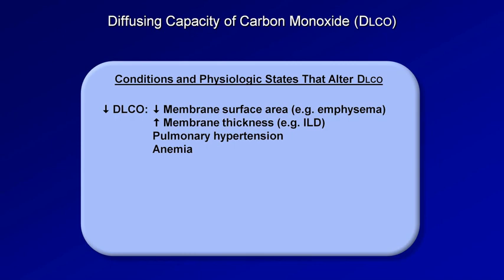Although it doesn't come up often in a clinically relevant context, there are a number of reasons why the DLCO could be higher than predicted. Exercise immediately prior to the test increases cardiac output, and the supine position changes the distribution of pulmonary blood flow and ventilation. Asthma has been empirically found to be occasionally associated with an increase in the DLCO. This has been speculated to be due to increased perfusion of the lung apices in asthmatics, though I personally wonder if asthmatics may also have increased surface area of the alveolar capillary membrane due to modest hyperinflation.